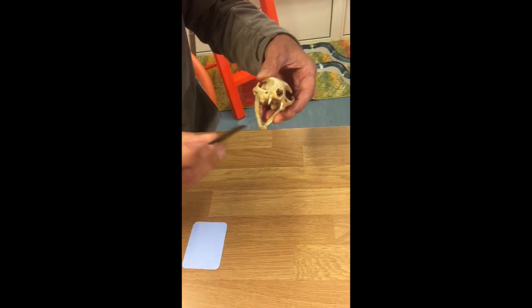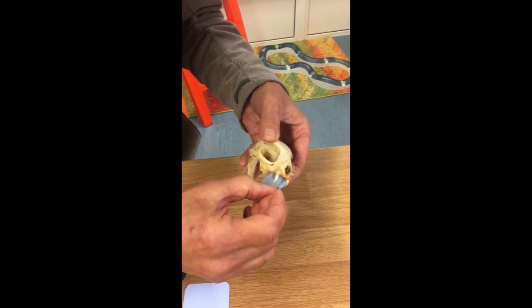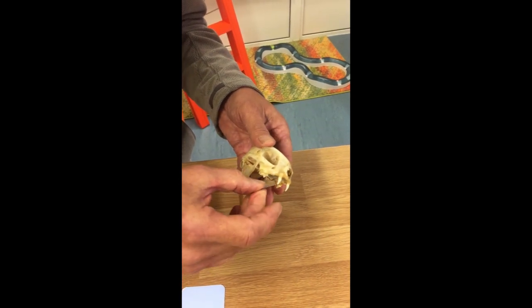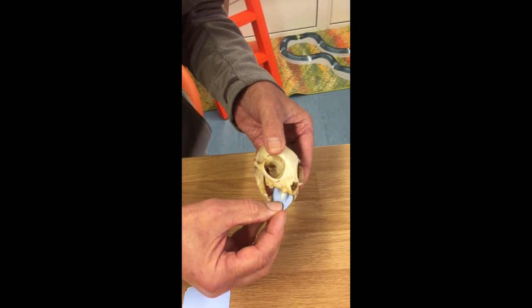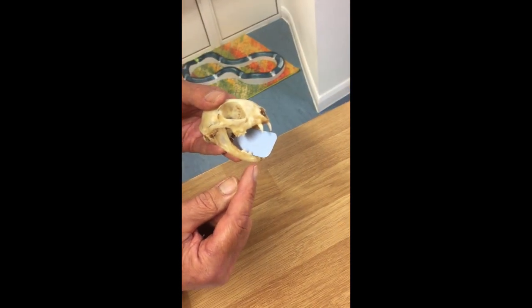So here we tuck this as tight as it'll go on the far side of the mouth, so held in by the carnassial tooth and the canine. On this side it's held by the non-existent canine which has disappeared.